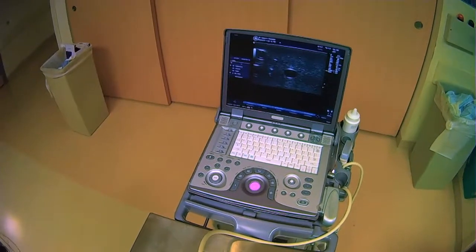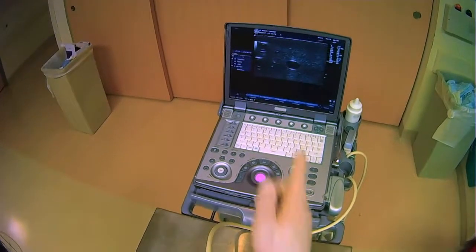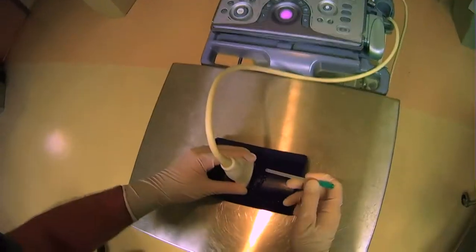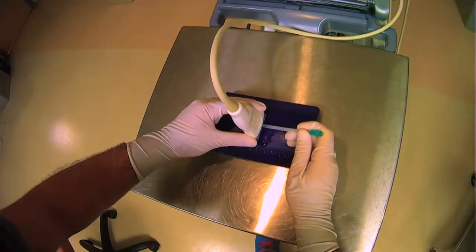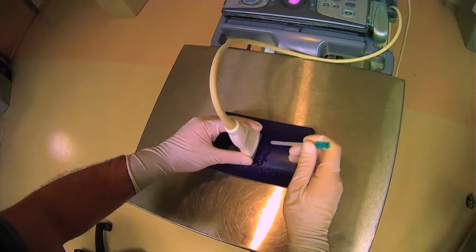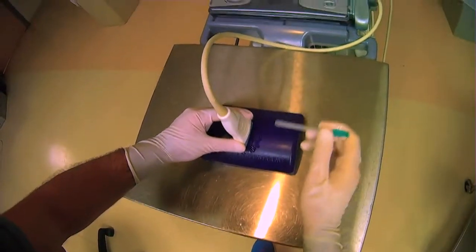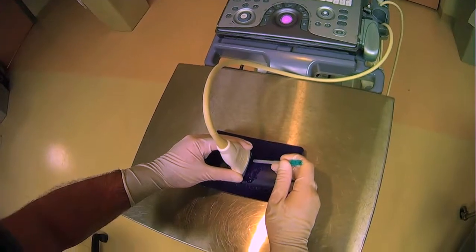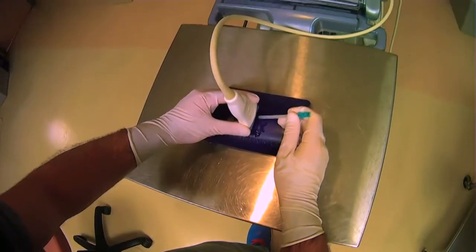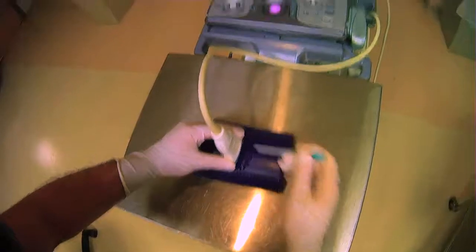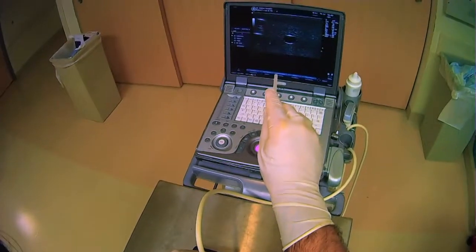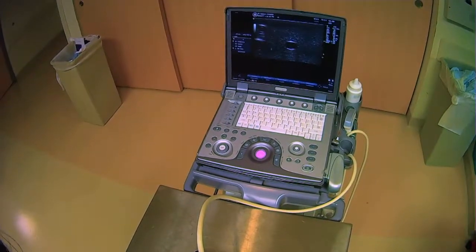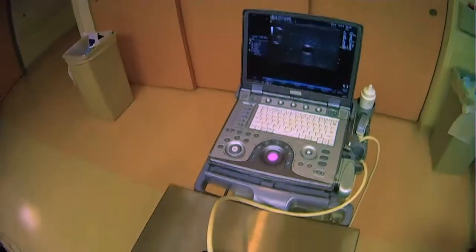The reason for this is because the middle of the screen corresponds to the middle of this probe. So once we get to the point of actually putting in a needle with our ultrasound guidance and trying to get access to that vessel, we can just go into the middle of the probe as our entry point. We'll know that we should be pretty close to right on target with the vessel, because it's in the middle of the screen and that corresponds to the middle of the probe.